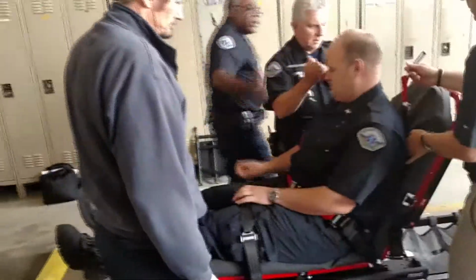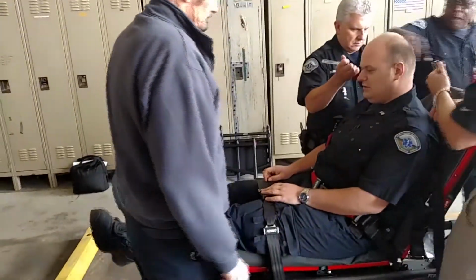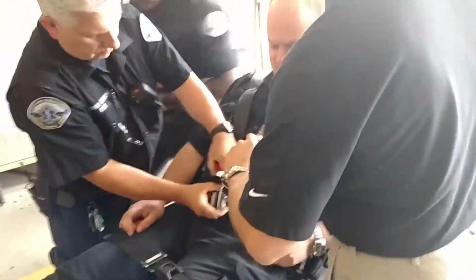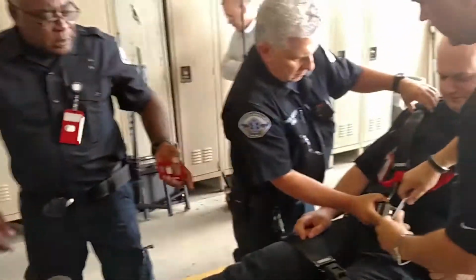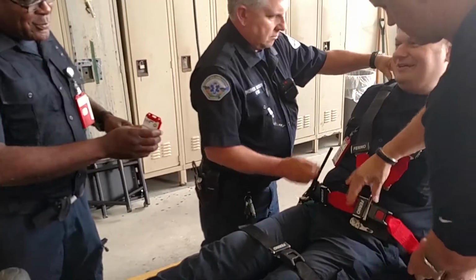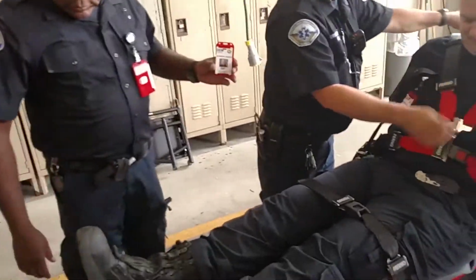What's the length of the pad? So we've got to get these guys here, red to red. What's the whole overall length of the pad from head to toe? Question, I haven't memorized that. I have it on my spec sheet though. I'm just looking at this little short guy where his feet are at. Yeah, my butt's in the crease. But he's got the extenders out, which is really nice, I like that.